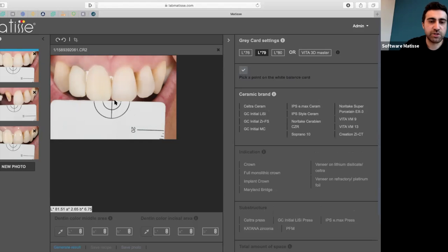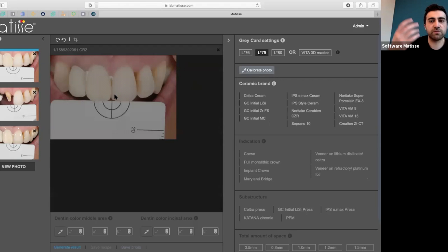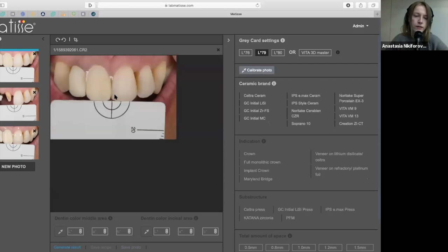And now I always choose the side of the circle where my target tooth is. So I click here, then it says click here to calibrate. Now in the background the software is calibrating the picture: the white balance and exposure.